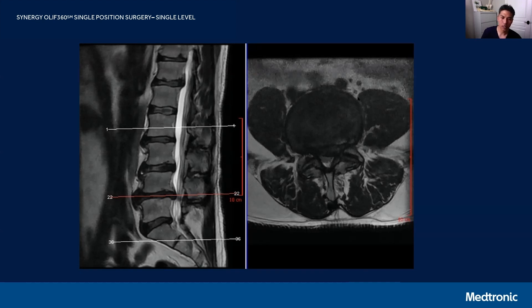What can help facilitate manipulating it is to have the anesthesiologist relax the patient. When they do that, the psoas becomes a lot more compliant and it's easier to reflect back and retract posteriorly. Because a lot of the lumbar plexus nerves are contained in the posterior aspect of the psoas, when you reflect the muscle back, you almost never encounter those plexus nerves. So you're safe retracting the psoas — it pads all your lumbar plexus nerves and your femoral nerve, and it facilitates the exposure.